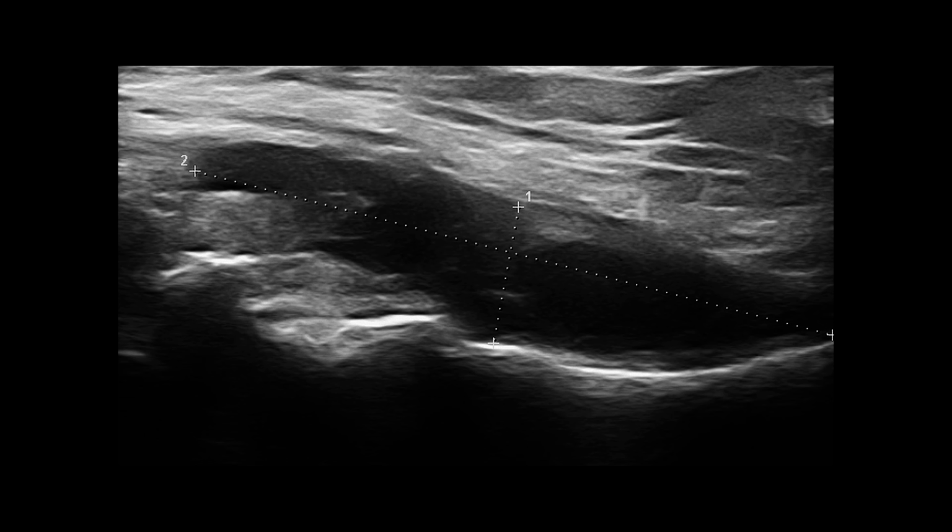While such lesions may be related to local tendon pathology, this appearance may also represent a medially extending parameniscal cyst originating from the medial meniscus. In such cases, the cyst may remain in continuity with the meniscal tear and extend distally toward the Pes Anserinus region.